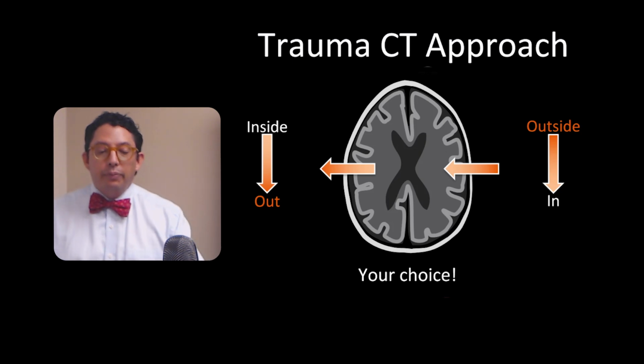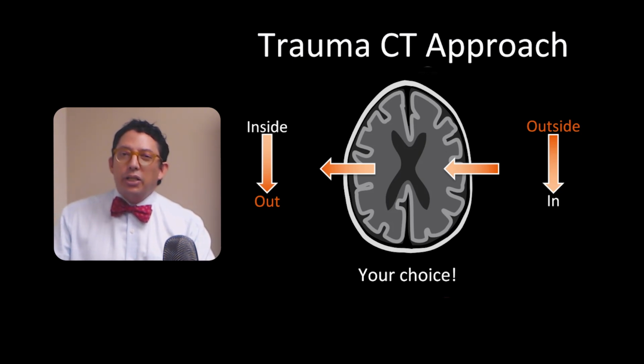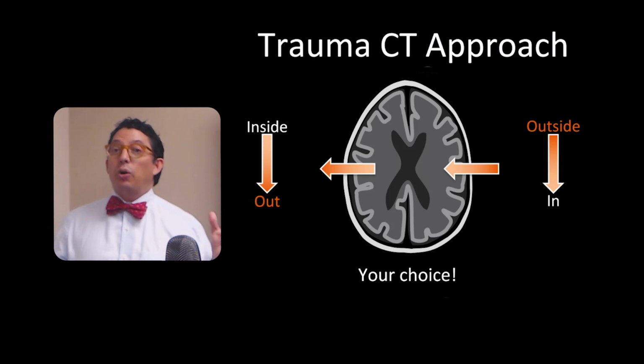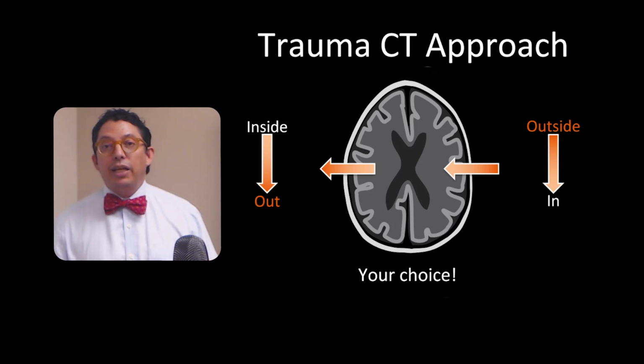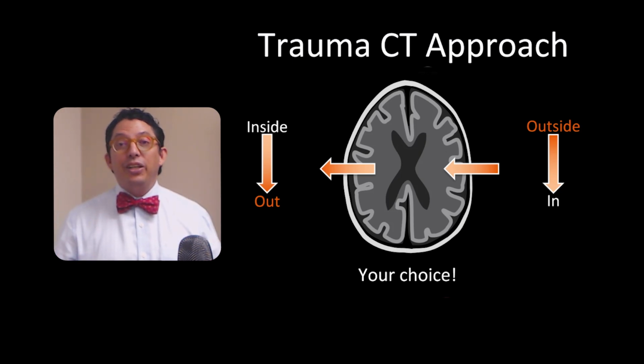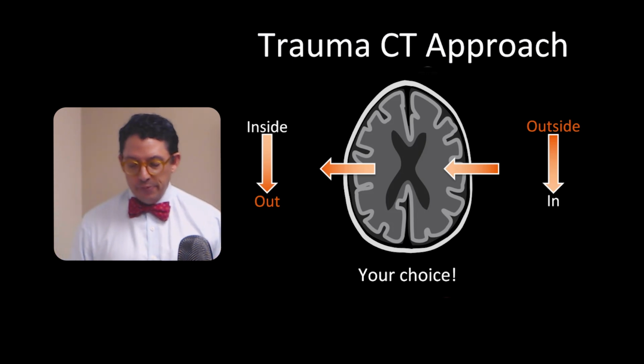One of the biggest biases that we have in radiology is satisfaction of search. That is that you're looking at a case, you see a finding, and you get so excited about that finding that you forget that you have to look at all the other things, and maybe the secondary findings that you missed are the most important for the patient, or are the true clues of what is going on with this patient.